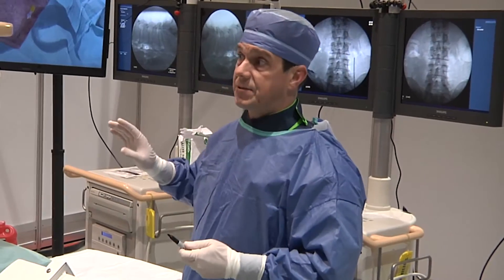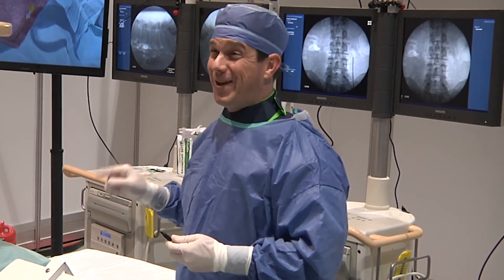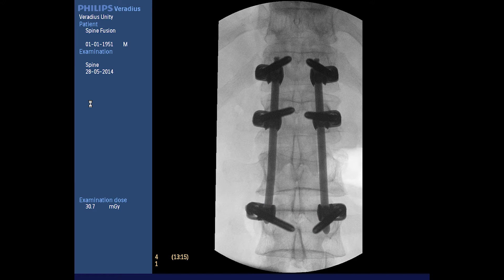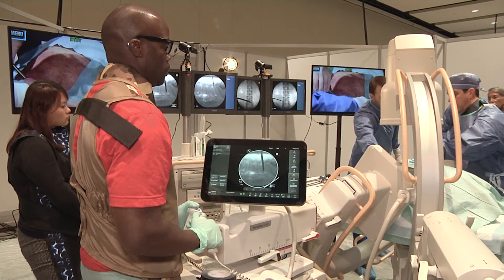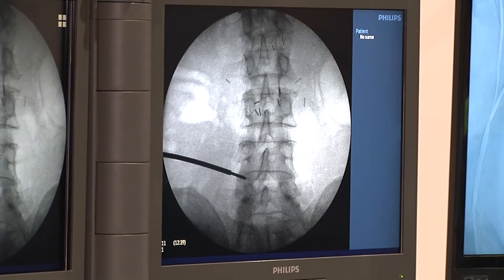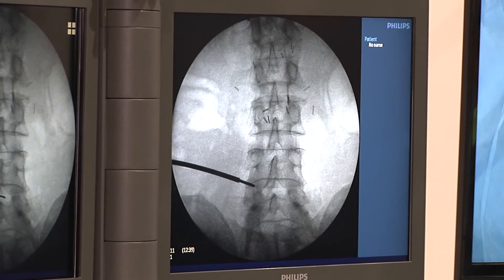I'm familiar with the Philips C-arms because they're quite common in Europe, and I've had the chance to use some of the models. Yesterday in the cadaver lab I used the newest model and was very pleased with the quality of the picture. Not only did I notice good quality on the touchscreen user interface, but the monitor that the surgeon is looking at seemed to be an even better quality — I was very impressed by that.